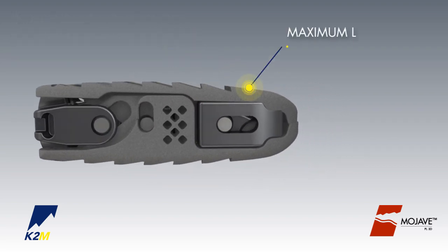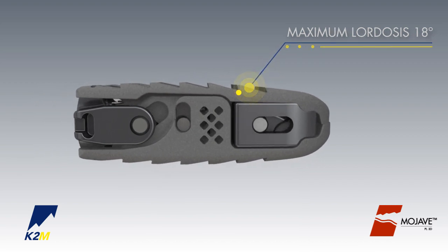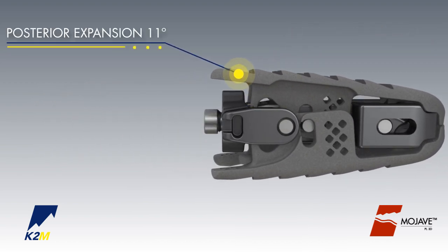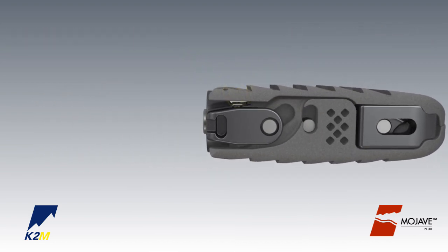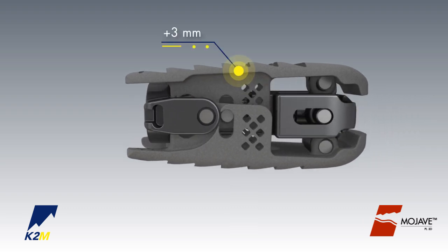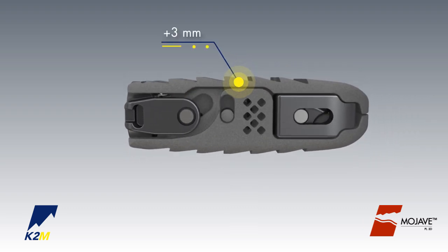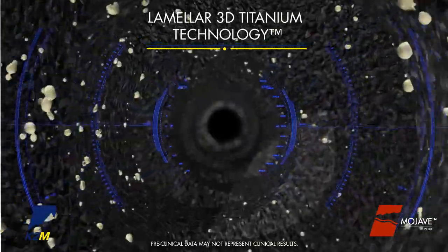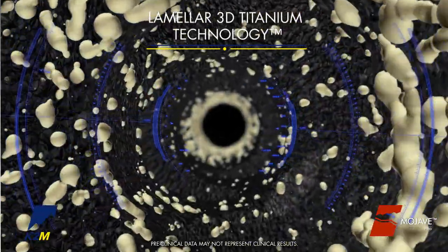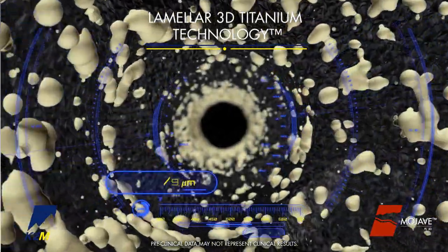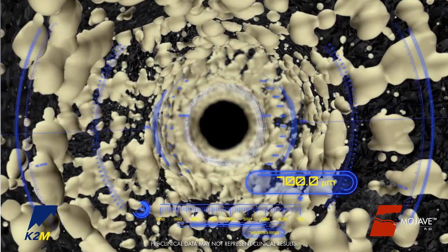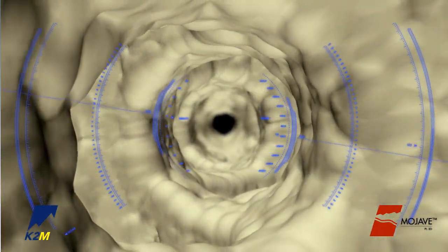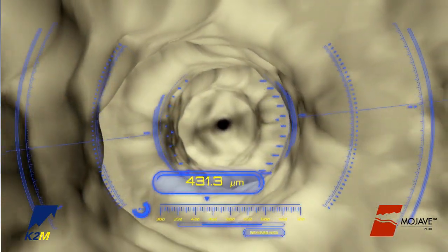Featuring infinite adjustment within the expansion range, the implant may be locked at any desired height and lordosis to aid in the restoration of sagittal balance. Designed with K2M's Lamellar 3D Titanium Technology, Mojave incorporates porous structures along with rough surfaces to allow for bony in-growth and on-growth throughout the end plates.